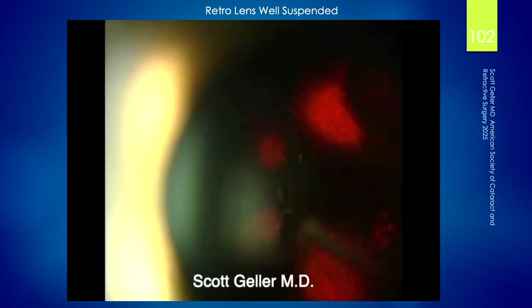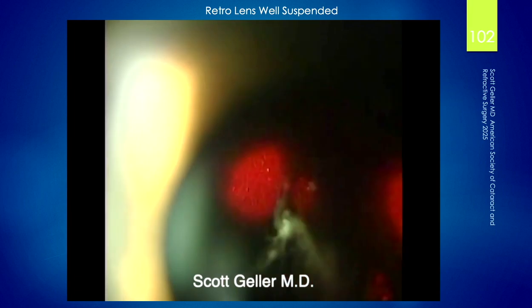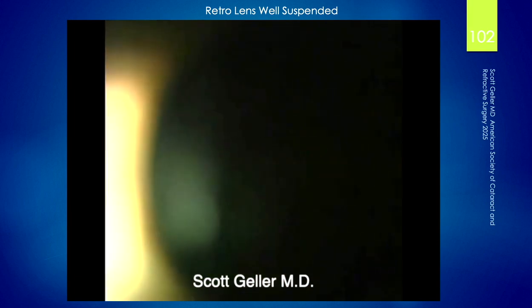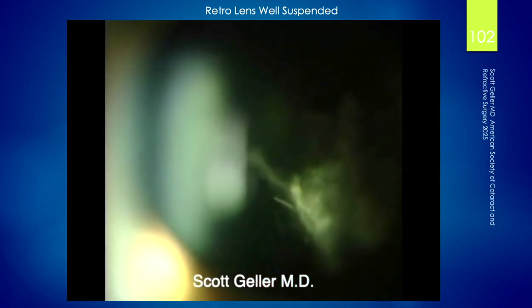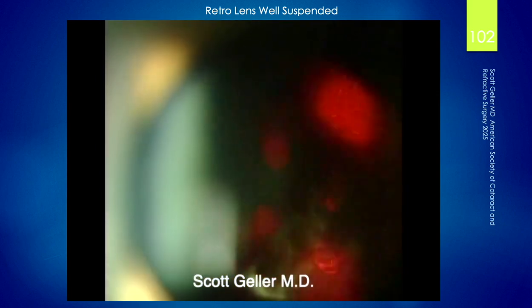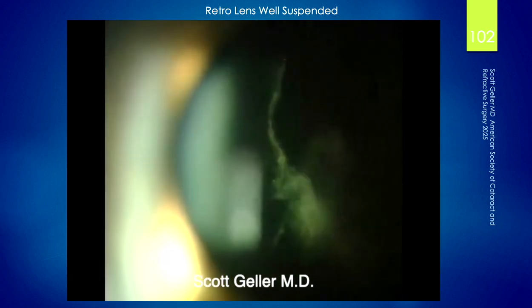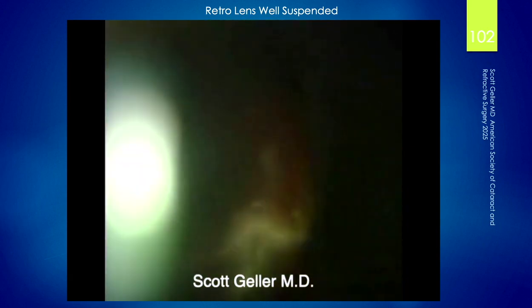Now, this always takes several sessions, but if you get this out of the visual axis, the patient will be a happy camper. Something like this in the periphery is no problem to the patient because they know the downside of having it in the visual axis. You can see it's already moved a little bit there. There we go. There's a little more there. Just go slowly. This is going to take more than one session. Cut those supporting strands, and you will have a happy patient, a happy phakic patient.